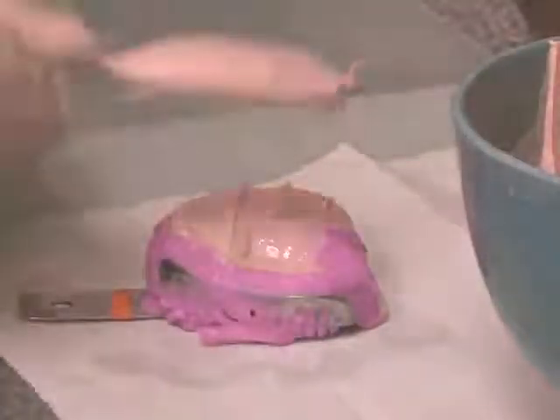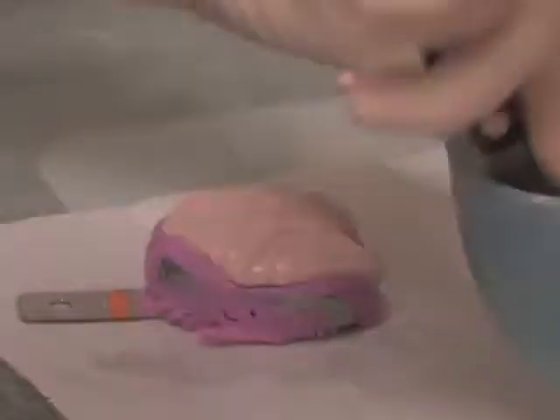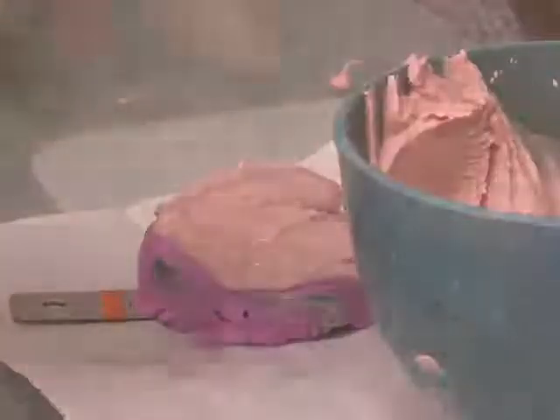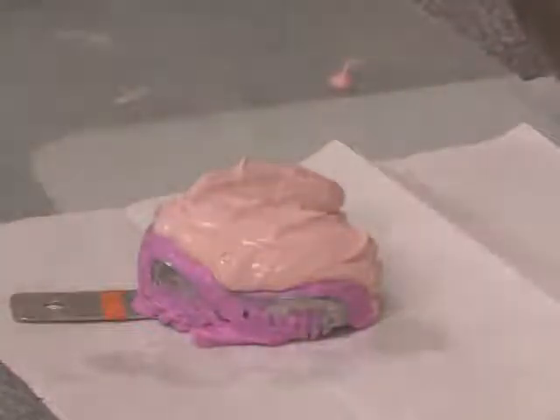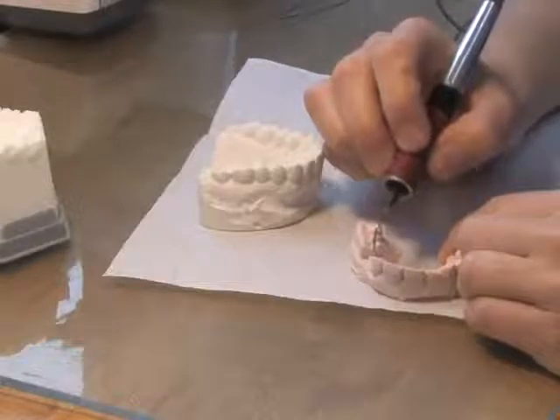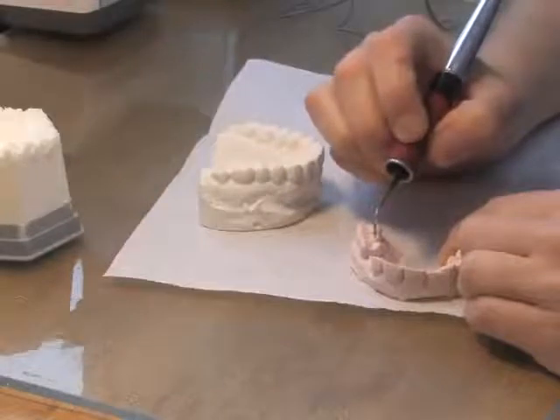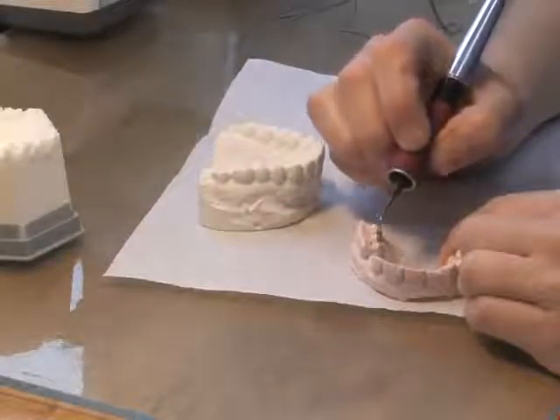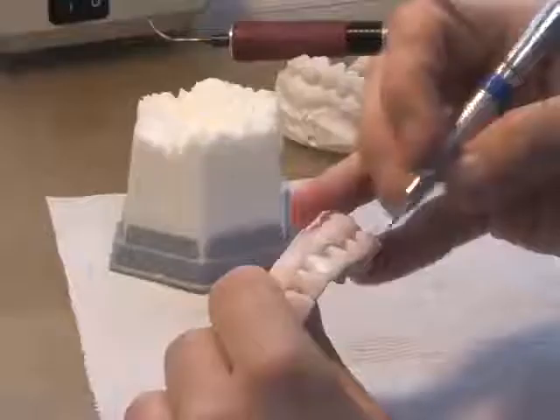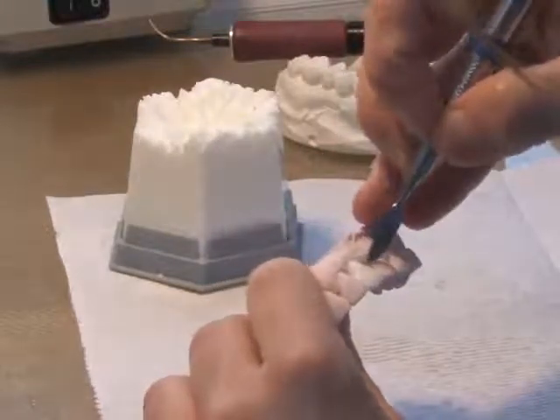While the implant is going to be reduced in terms of height and slightly prepared to make sure that there's no early contact, a lab model was fabricated to assist us in a transitional appliance being made that will protect the implant during the healing phase. This is very important, and the way we use it is a quick setting stone poured up the day the patient arrives prior to the surgery, and waxing up of the undercuts is then facilitated.